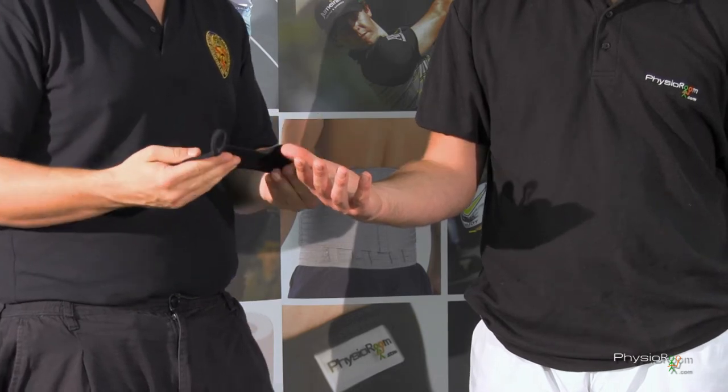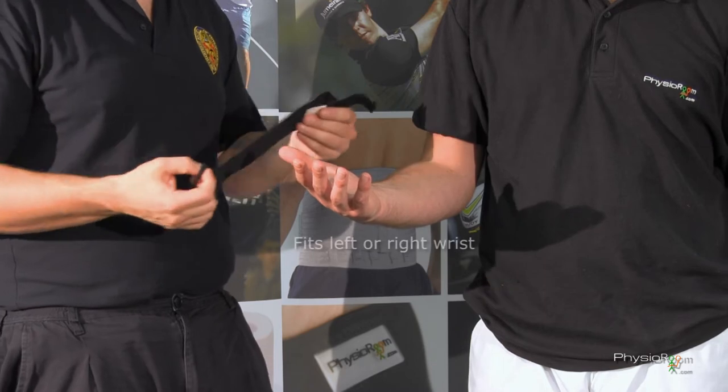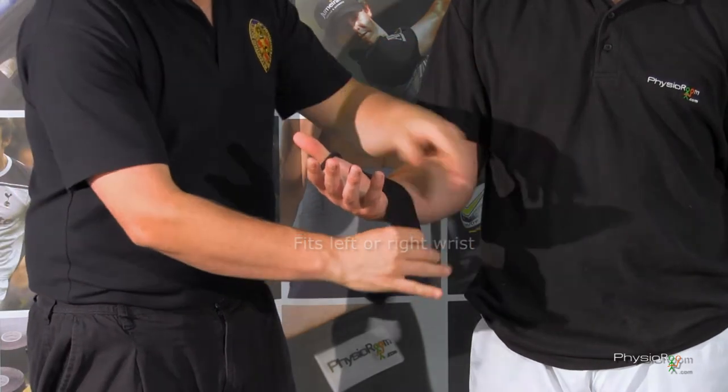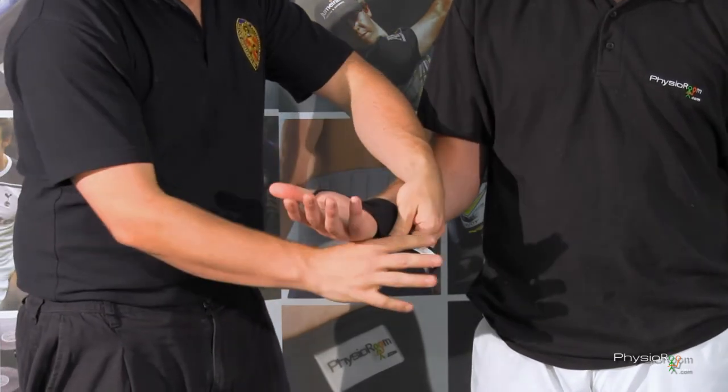I'm just going to talk about the Elite Adjustable Wrist Wrap — a nice, easy product. There's a thumb loop for easy application, just to slide on, to get it in place nice and tight, just to give that wrist some support.